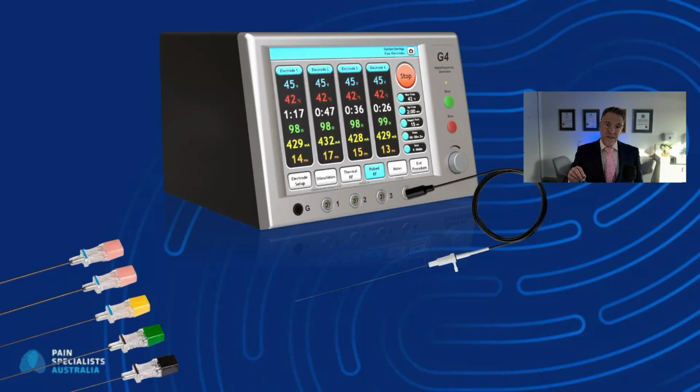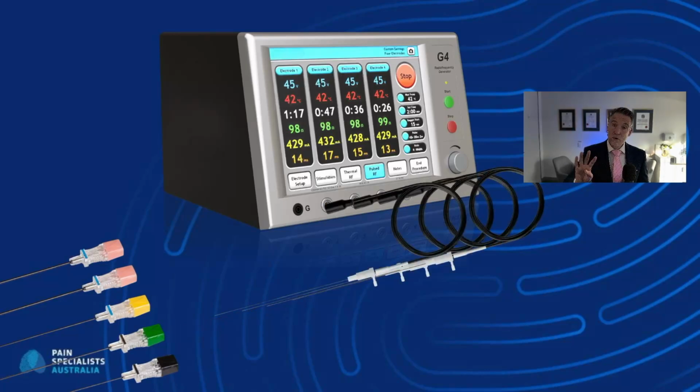The needle tip is connected to a radio frequency machine that we can control, and the radio frequency machine is connected to the needle via a probe that is connected into the machine and then into the needle. And as you can see from the front of that radio frequency machine, there are locations for 4 probes, so we can focus treatment on 4 needles at a time. And that makes sense, doesn't it? Because to desensitize one facet joint, you need 2 needles, because you have 2 medial branches that you need to focus on. And of course, sometimes there's more than one facet joint to treat at a time.